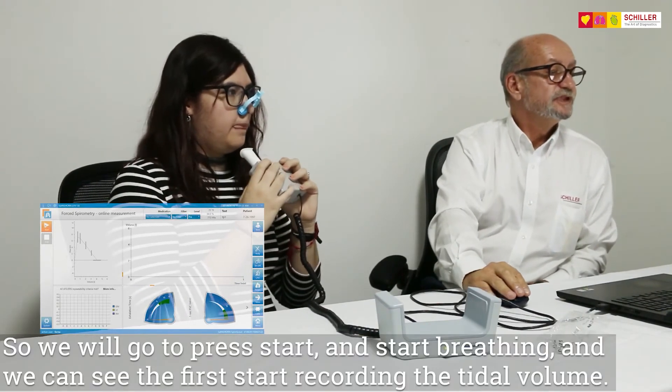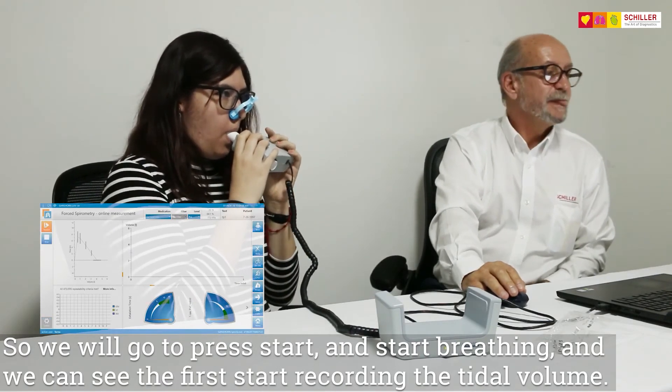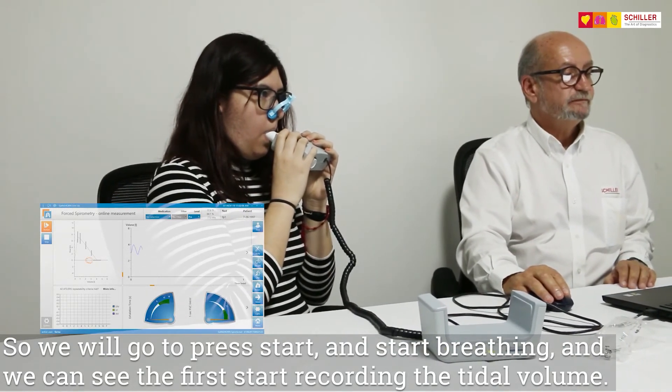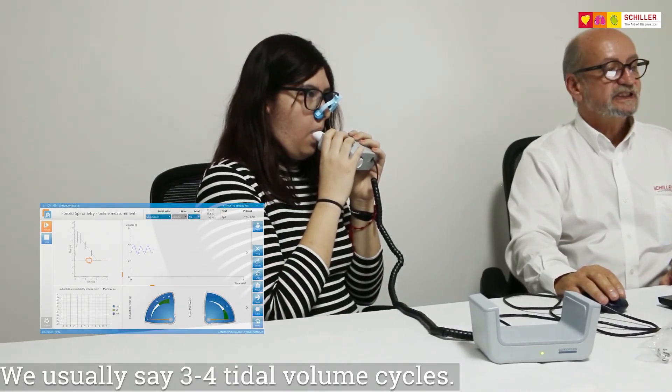Just put Start and start breathing. As we can see, we first start recording the tidal volume. We usually say three to four tidal volume cycles.